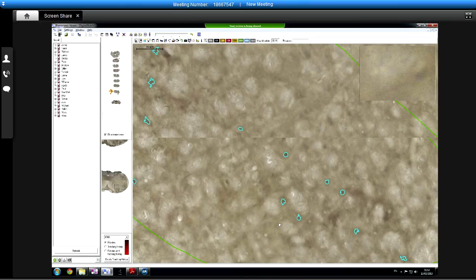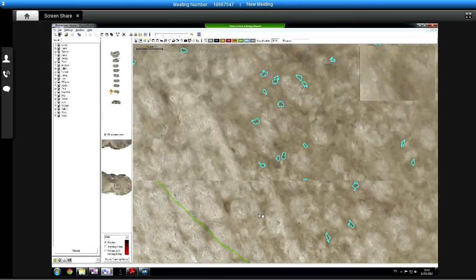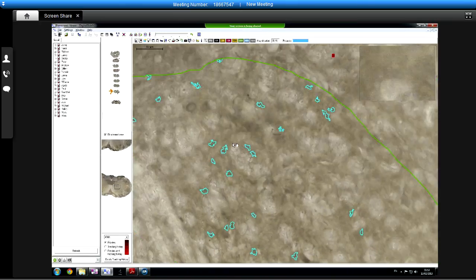These maybe are a little bit more questionable, isn't it? Mainly because they're quite out of focus, I'd say. Yeah. I mean, those I'd say. Yeah, you look at that. That's a positive.